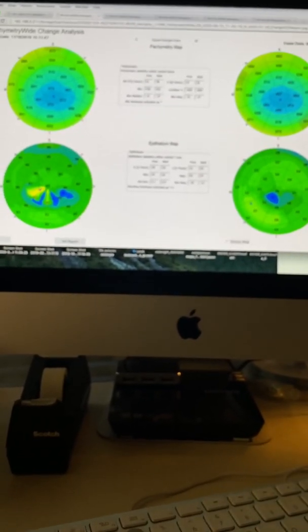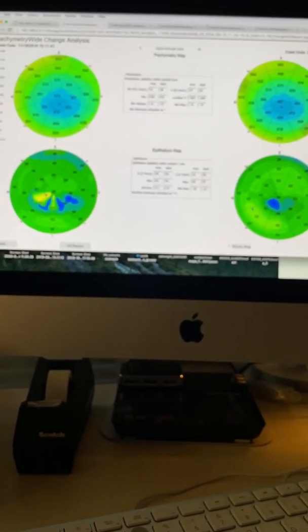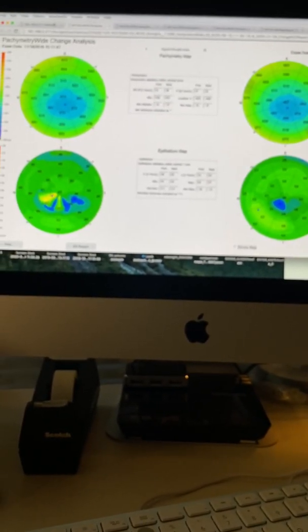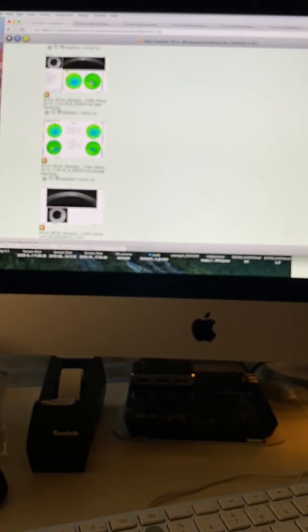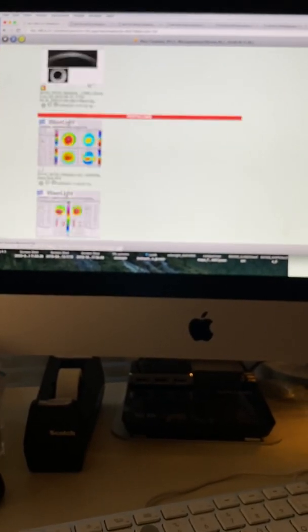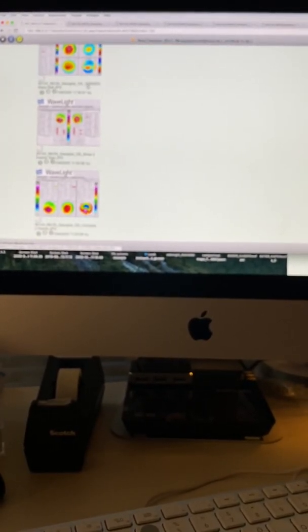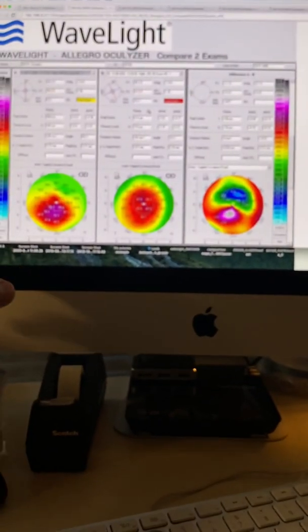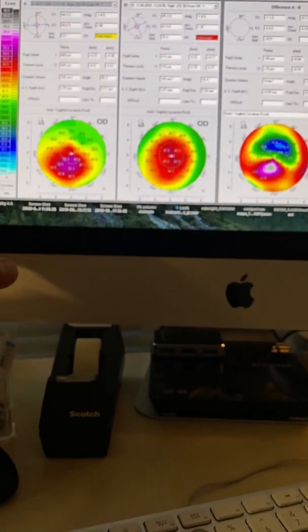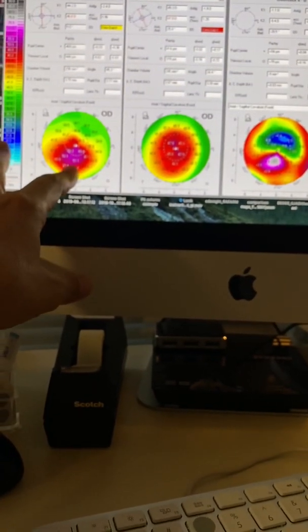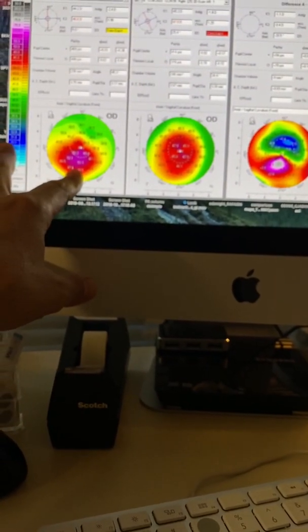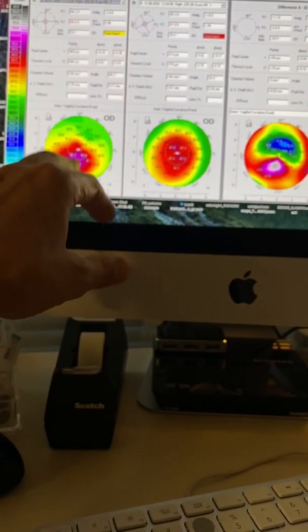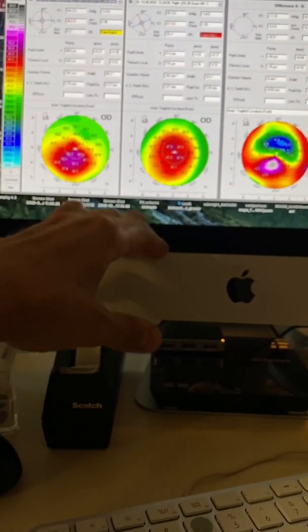So to wrap up, let's go look at the Pentacam maps before and at one month. This is the miracle of employing the Athens Protocol for keratoconus in a young adult. We not only have stabilization of the cone, but a dramatic reforming of the cornea.